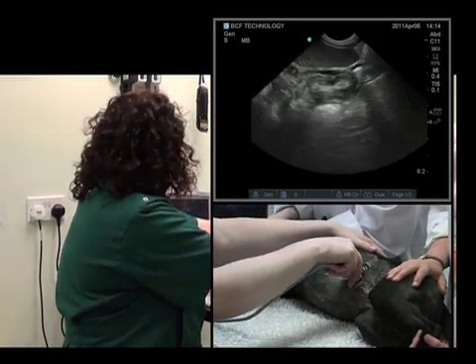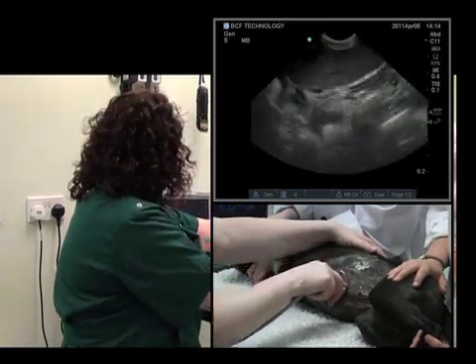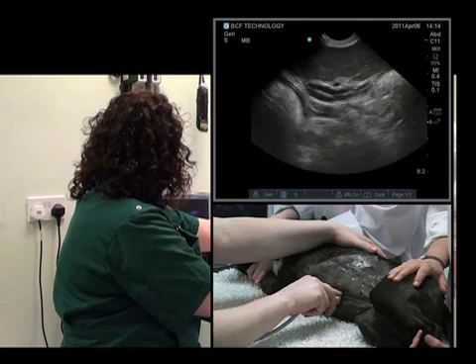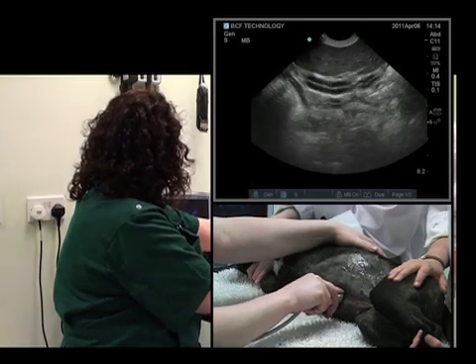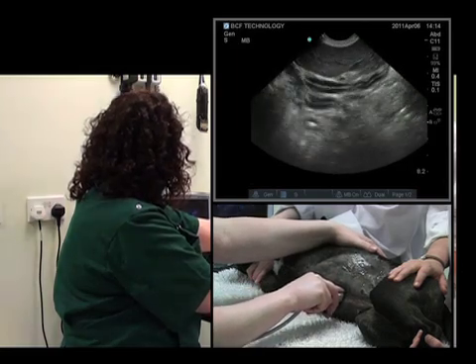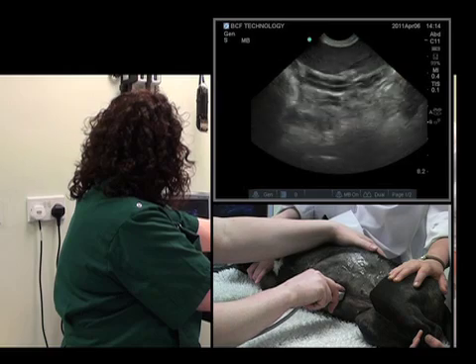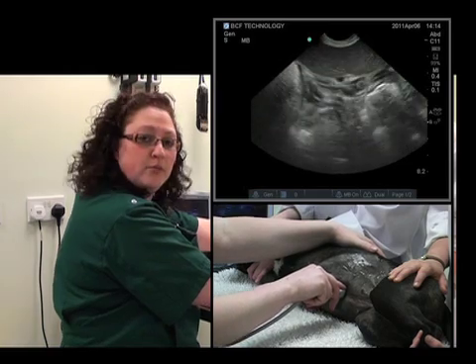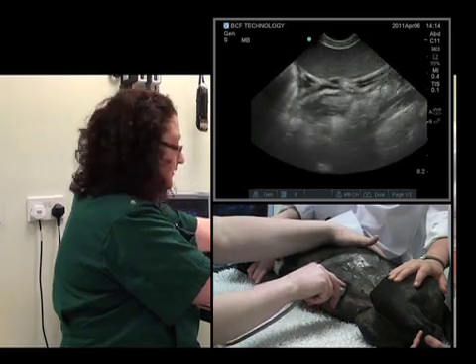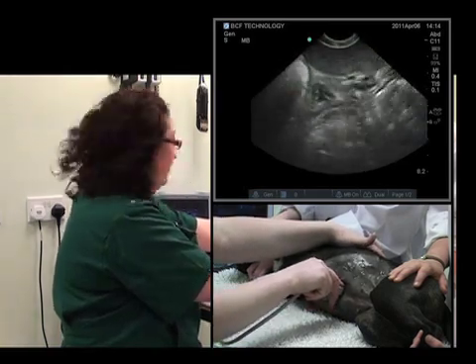So we'll slide along, and we can stop and look at any loops that take our interest. At this point, we could perform measurements and calculations of wall thickness.